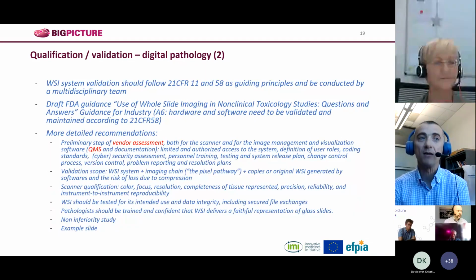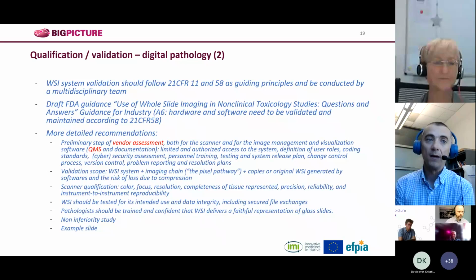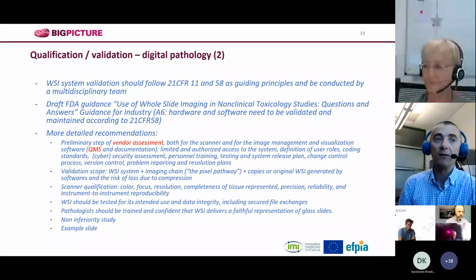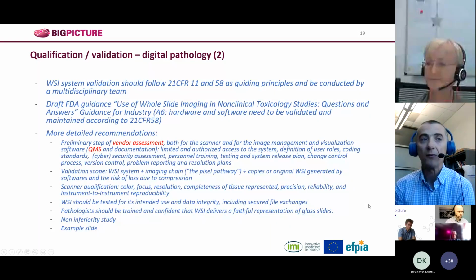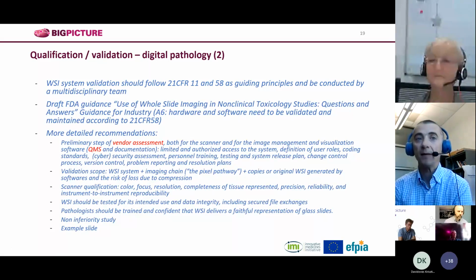And honestly, we copy some of what's been done in terms of the clearance of the scanners for medical use. And again, the big thing is to make sure that we maintain integrity, in particular when we exchange files or when we modify the format of a file.